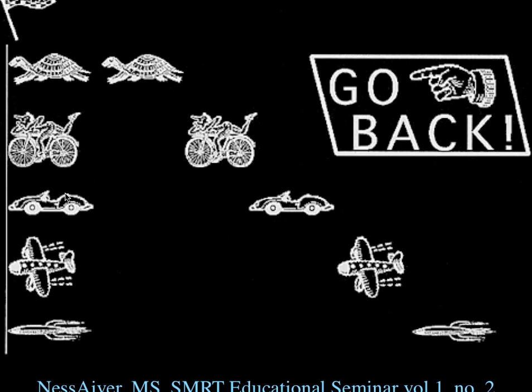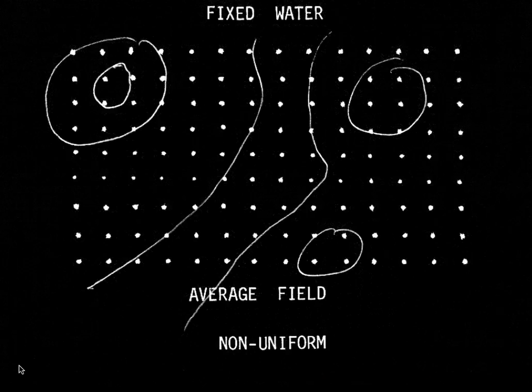So what we have then, just like this, we have some spins that are slow, we have some that are intermediate, and some that are very fast. But when we give the 180-degree pulse, what we're doing is telling them all to turn around, and now the fast guys will catch up to the slow guys, the slow guys will fall back to the fast guys, and at time 2 tau, they'll all be back in phase and we'll get a signal. Any questions?